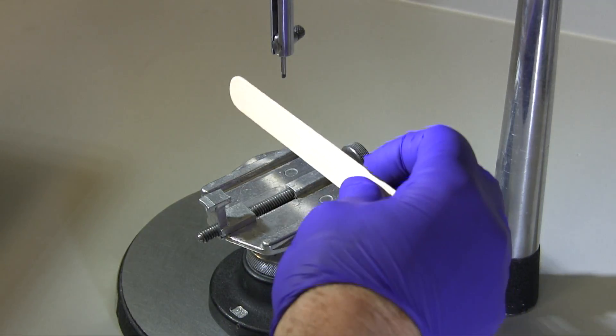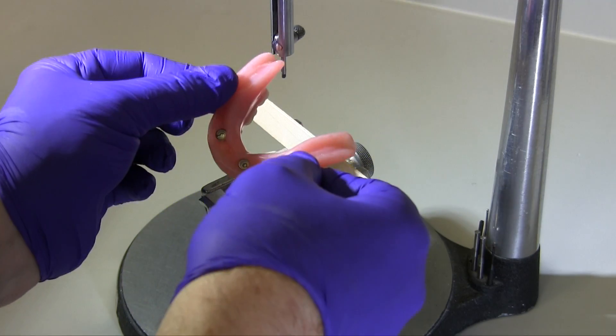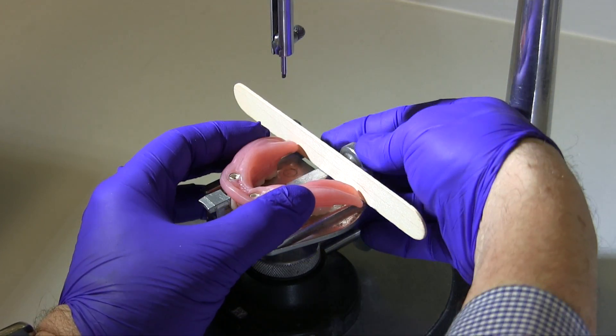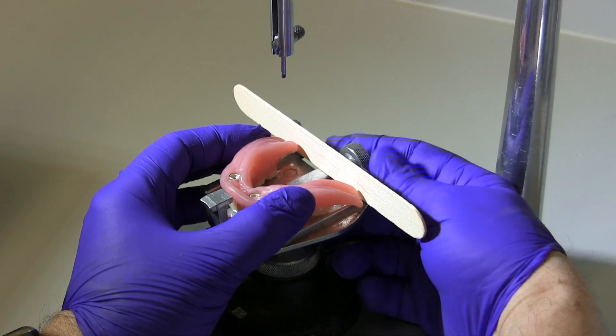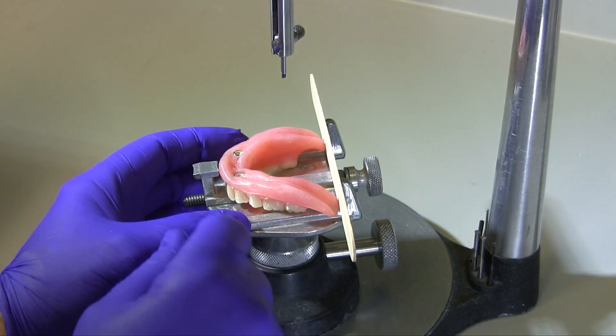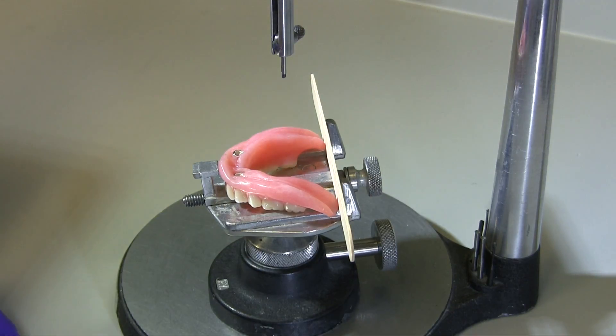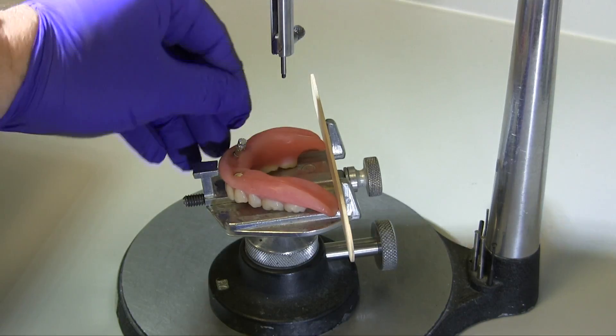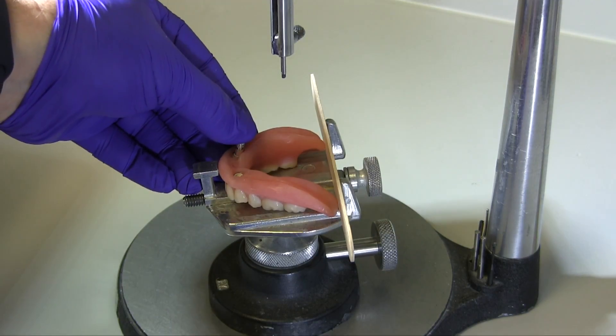Place the disinfected overdenture on the cast holder of a surveyor. Use a tongue blade at the posterior border to stabilize the denture securely in the jaws of the cast holder. Do not tighten excessively or the denture could break. The denture must not move in the cast holder for the subsequent steps. Place an implant replica into the attachment of the denture that is closest to the desired path of insertion.